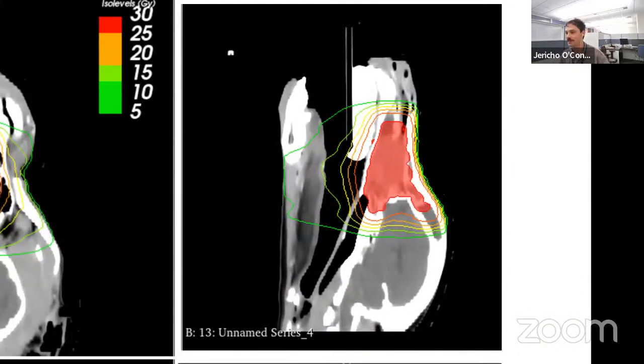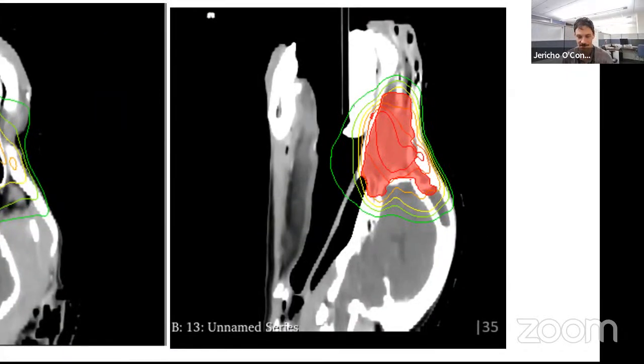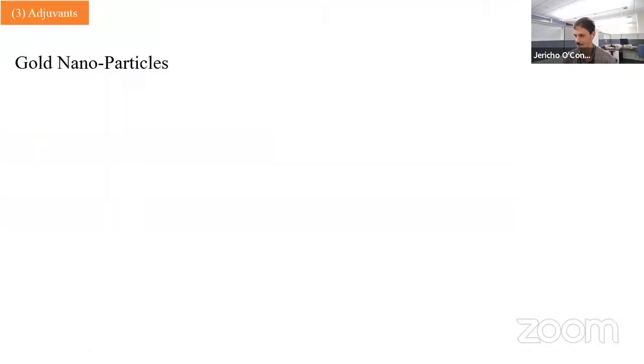And this is what they'd give as a treatment for this lesion. You can see it extending into the brainstem. This treatment would be really hard on the dog because you're going into the mouth a lot and into the brain quite a bit. When I tried to plan on the KV device, you can see that my optimizer isn't quite as sophisticated to really do what the VMAT could do with the MLC. So I can't quite get the arbitrary anatomy of the GTV, but it does spare the skin quite a bit, and I think it does a pretty good job. It can't pass any RTOG criteria for such a lesion, but it can do a pretty good job.